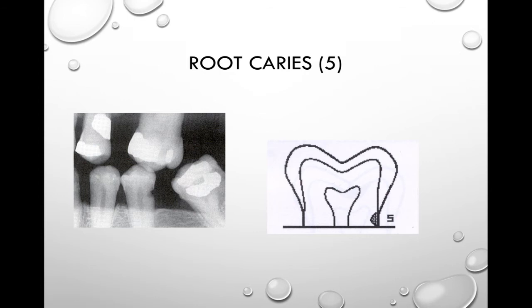Class five is root caries, which is more common in elderly patients. It is found just apical to the CEJ and can often be seen clinically. Root caries appears like a crater on a radiograph — very distinct, almost as if an ice cream scoop removed a portion of the tooth. It is often associated with periodontal disease, seen in areas with recession or bone destruction. On this radiograph, you can see a very distinct scooped-out area indicating root caries, along with an existing class five restoration from past treatment.